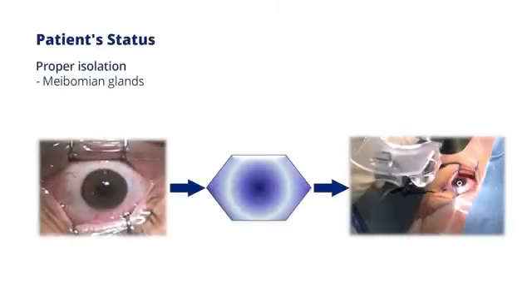To avoid the meibomian gland secretion or the eyelashes entrapped into the interface between the cone and the cornea, you can adjust the chin position and speculum to let the cornea position kept in the center of the hexagon as shown.